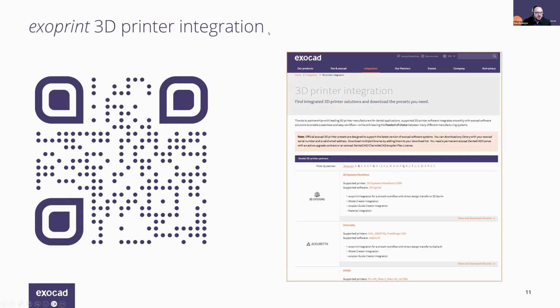I can speak from experience when it comes to adding new technology into your laboratory. You constantly have to call and see recommended settings, and look at the instructions for use sheet that comes with your resins. That is something you don't necessarily have to worry about. It's already preloaded for you.